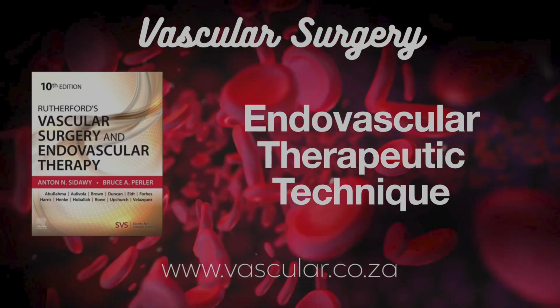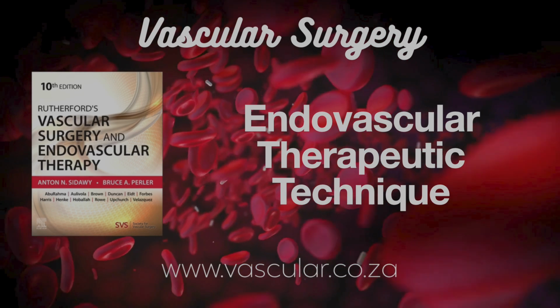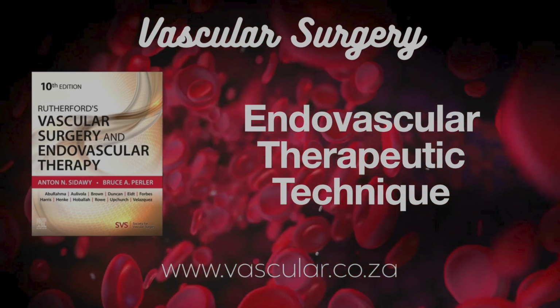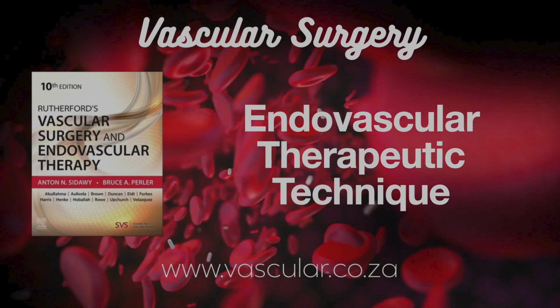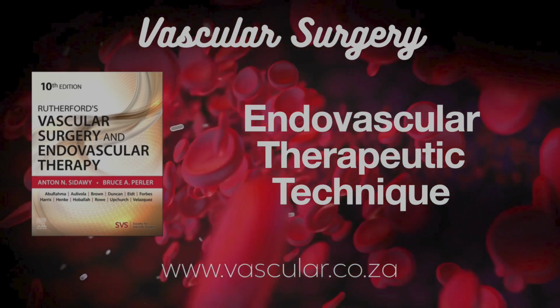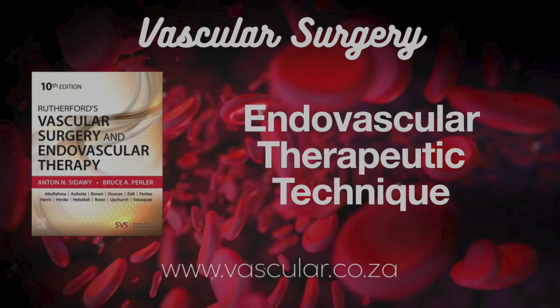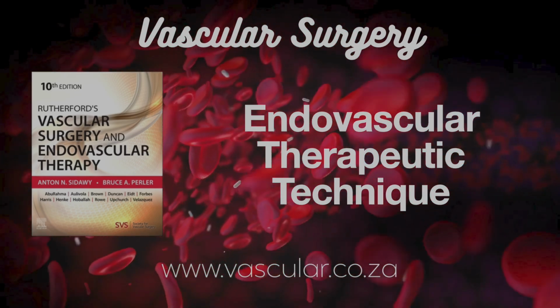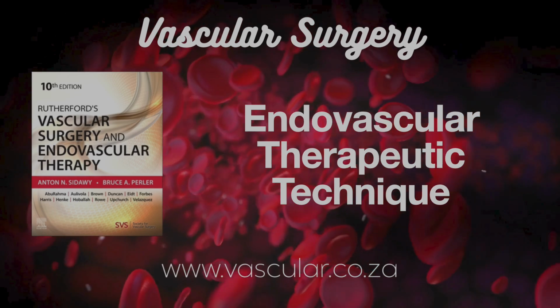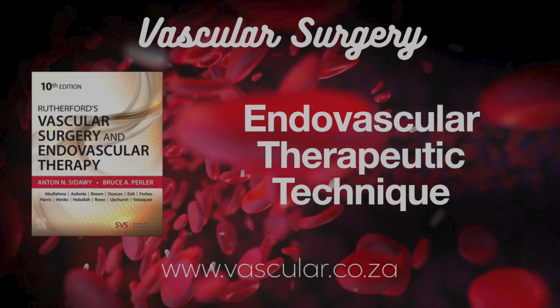Yeah, those coronary DES were helpful, but they had their own issues too, didn't they? Didn't always prolong life compared to bypass in some groups. That's true. Trials like SYNTAX showed limitations. Plus, patients needed long-term dual antiplatelet therapy, blood thinners, to reduce the risk of clots forming inside the stent, called subacute thrombosis. So how are the peripheral DCBs designed and used differently?